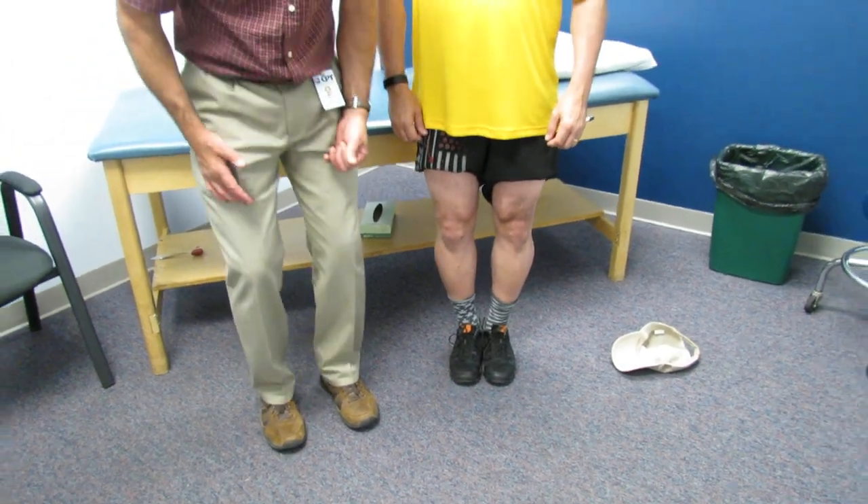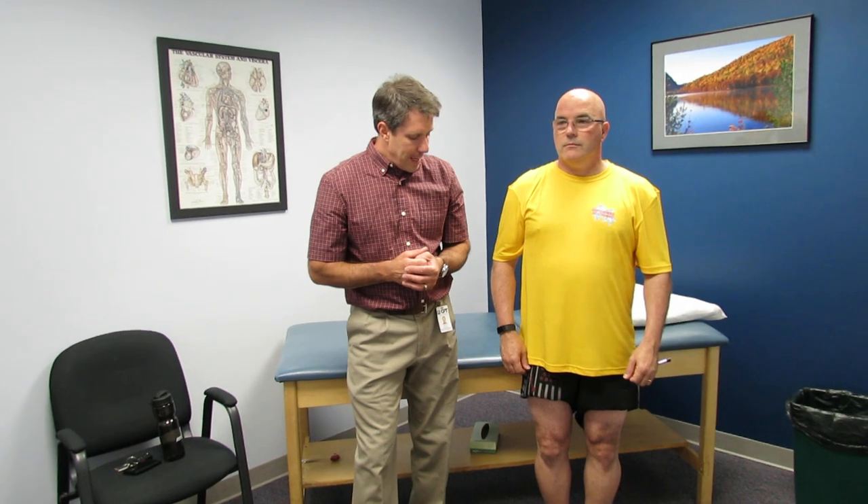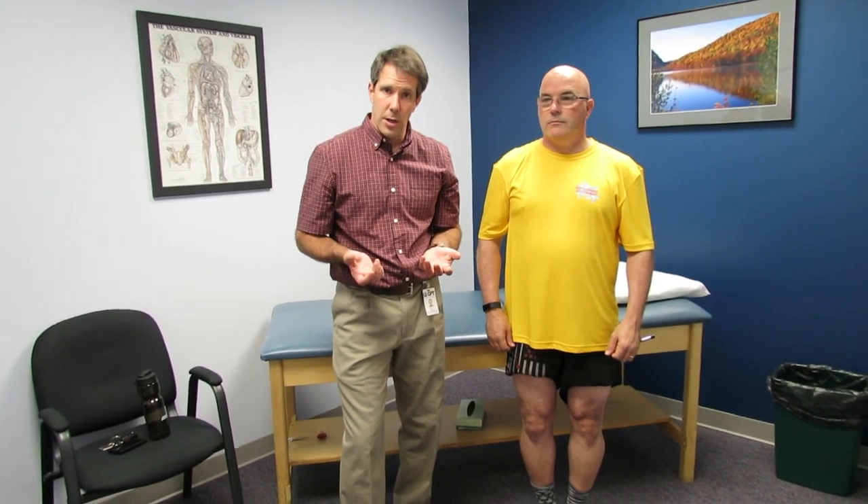He doesn't have a lot of swelling, he's obtaining good extension, and he has a great quad with good leg control. Most of his pain is when he is in weight bearing — when he stands, he bears weight on that medial aspect of his joint — and because the lateral side is looking really good, we're going to put him into an unloader brace.